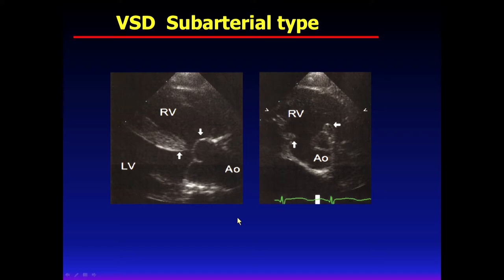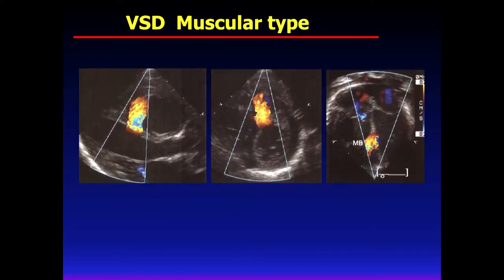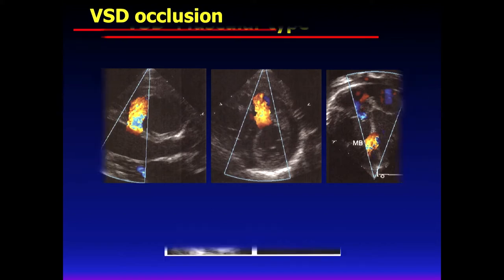That makes our decision urgently to make a correction or not, even though the shunt is small. And then this is muscular VSD. We can notice all the septum, and in between the apical septum or muscular middle septum and a little upper. So the device closure works well on this type of VSD.